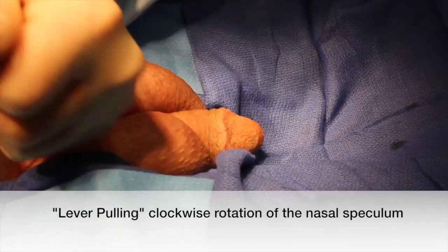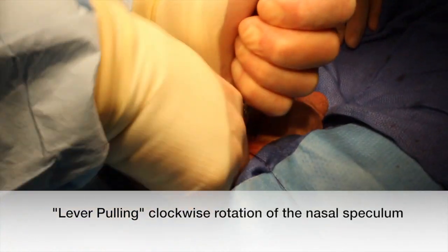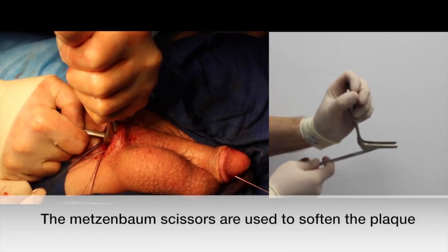Next, a lever-pulling clockwise rotation is used with the nasal speculum and the hook blade is used to fracture the plaque. Metzenbaum scissors are then used to further fracture the plaque.